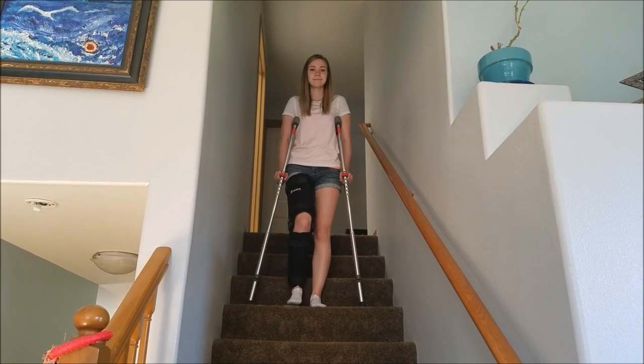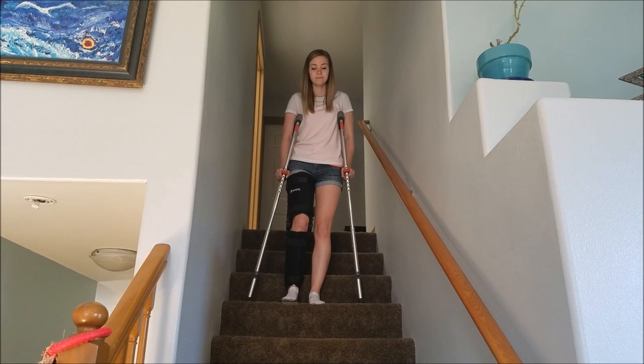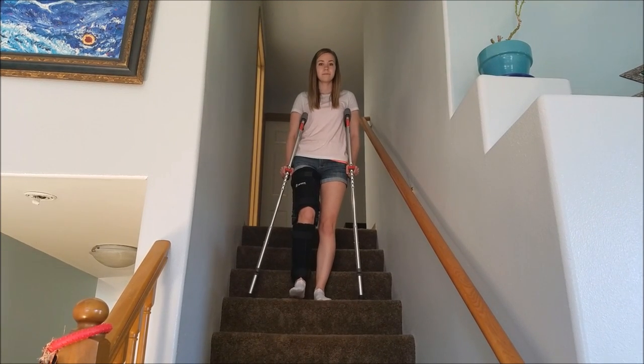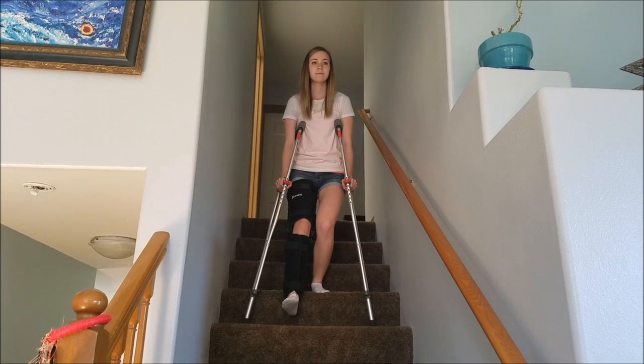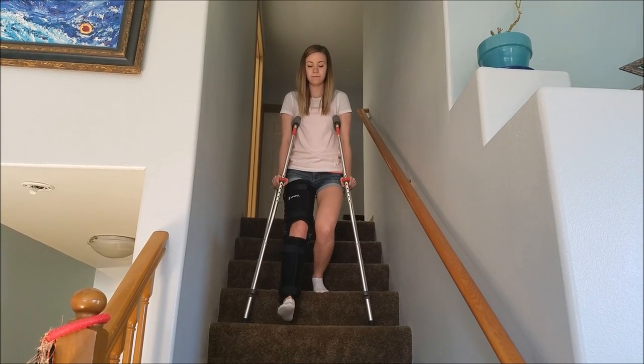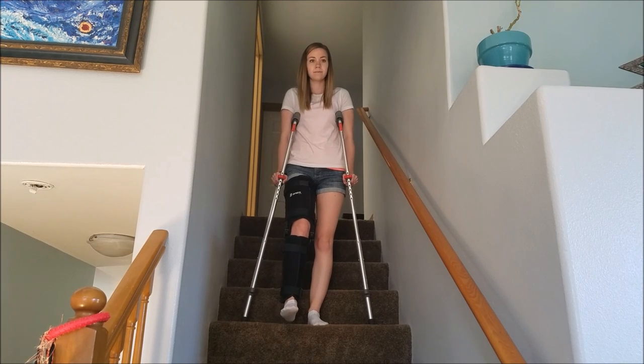Walking downstairs. Shift weight to good leg. Keep injured leg extended in front of you. Lower crutches to the next step. Rest weight on crutches, then lower the body down to join the crutches.